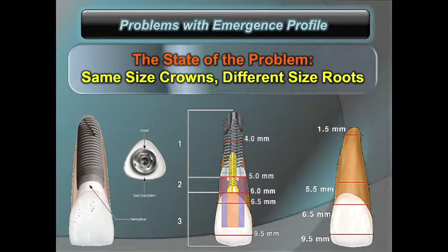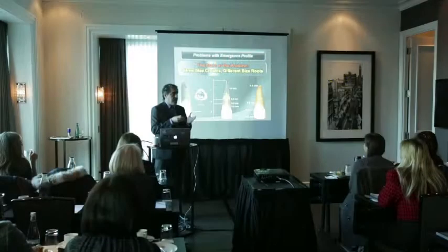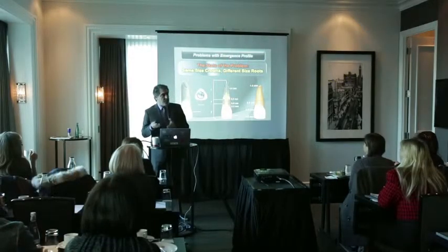Now, the problem is that when we are restoring our implants, the crown size is always the same. You can't make a smaller crown, especially for the aesthetics. So the size of the crown is always the same. However, most of the time we don't have the luxury of placing large, wide implants, because we don't have enough bone in most cases.